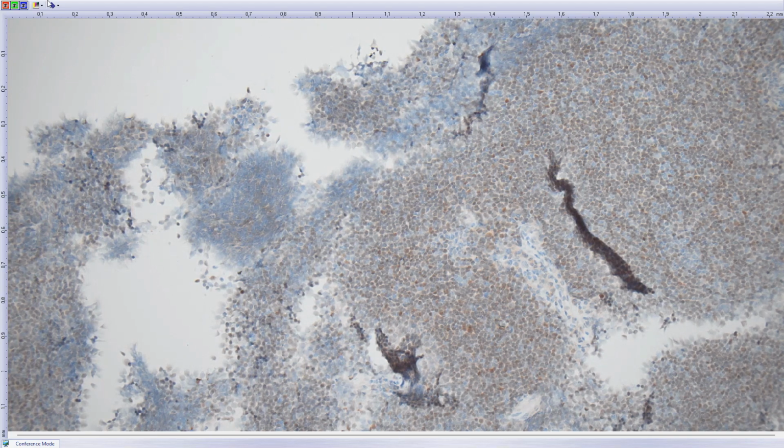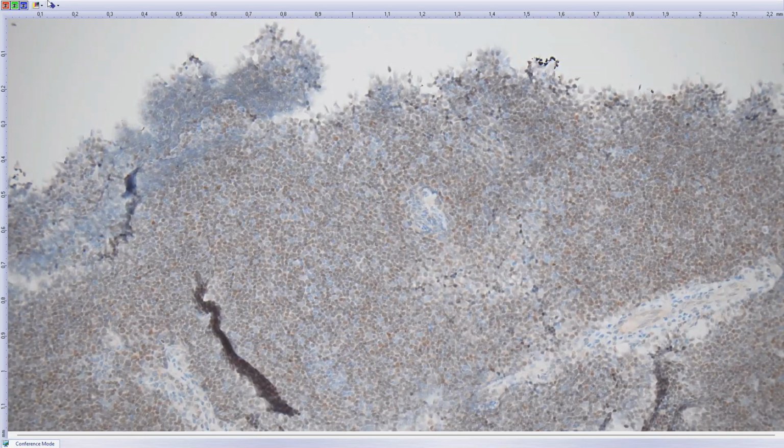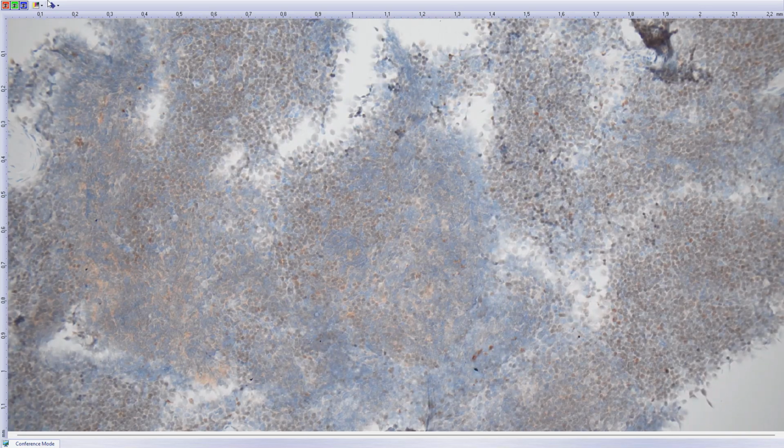And the typing based on a small biopsy is always difficult, but in this case, I believe it can be typed as B2 Thymoma. So no undifferentiated malignancy, but Thymoma. You should always have it in your differential diagnosis when dealing with lesions from the mediastinum.